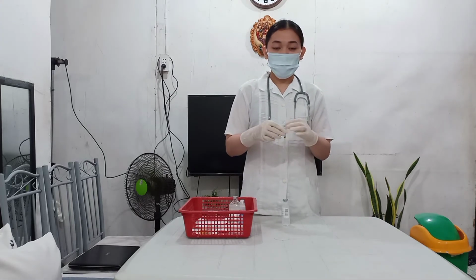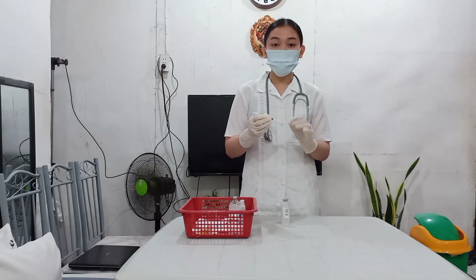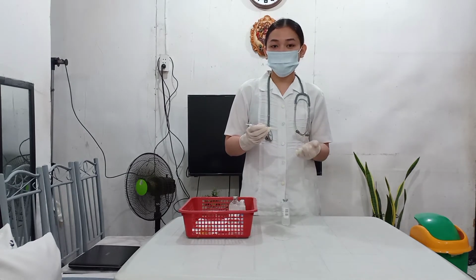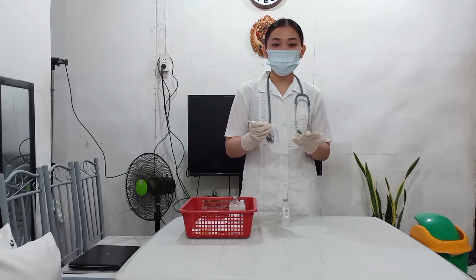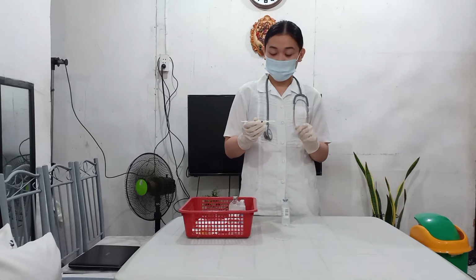Now, after which, we will remove the cap from the filter needle and insert the needle into the center of the ampule. The rim of the ampule is considered contaminated. Now, use of a filter needle prevents the accidental withdrawing of small glass particles with the medication.